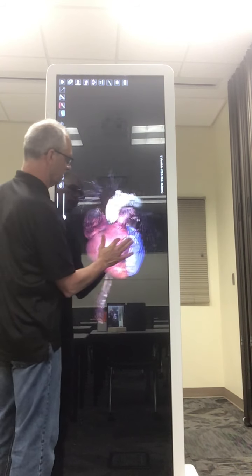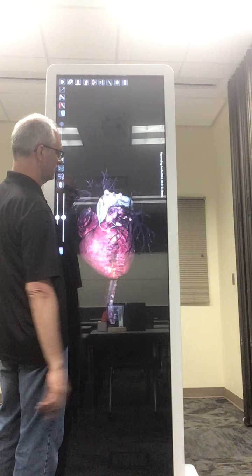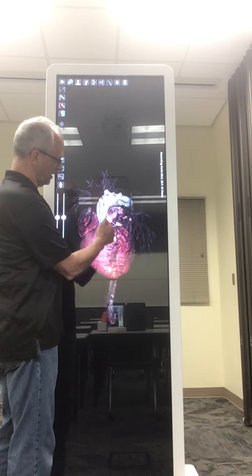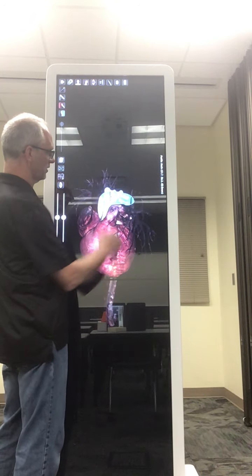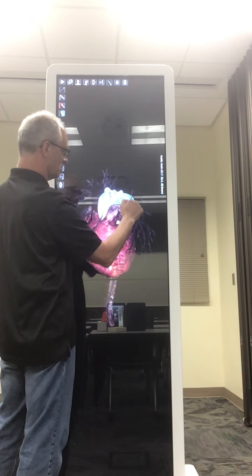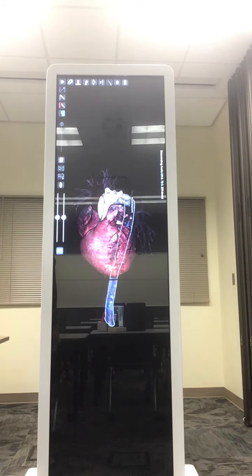Turn that around a little bit, we can see that the left ventricle then connects to this, which is the aorta. You see how that connects from the left ventricle? Ascending aorta to the aortic arch, gives off those three branches we saw before, and then leads down to the rest of the body to the descending aorta.